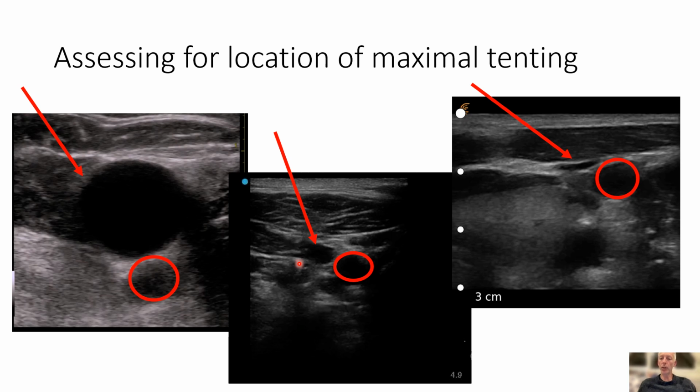The distended portion of the internal jugular vein is below the level of the probe, in other words, closer to the right atrium. Lowering the head of the bed may better reveal the location of the distended portion of the IJ. The image on the right shows a collapsed IJ. This is well beyond the level of maximal tenting. The height of the JVP is below the position of the probe. Lowering the head of the bed may help reveal the column and location where there is maximal tenting.